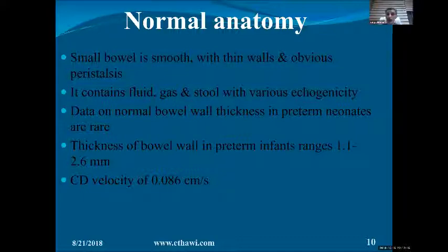The difference between pulse Doppler and continuous Doppler is, in continuous you are looking at all the structures in the way of the ultrasound wave, while in pulse Doppler you select a window through this structure.